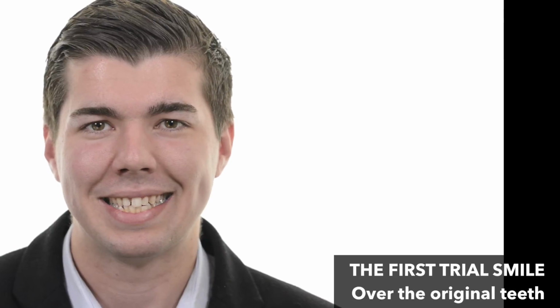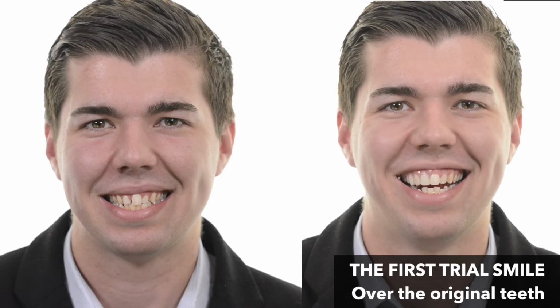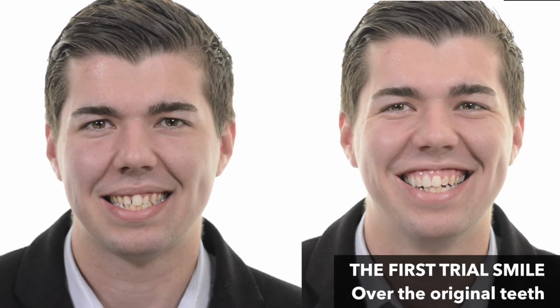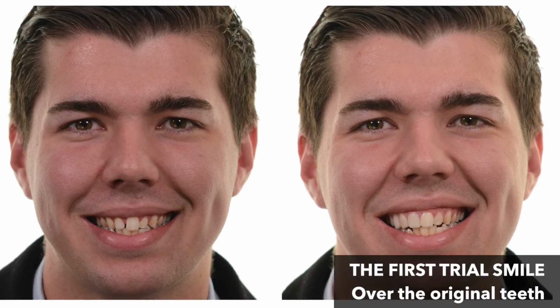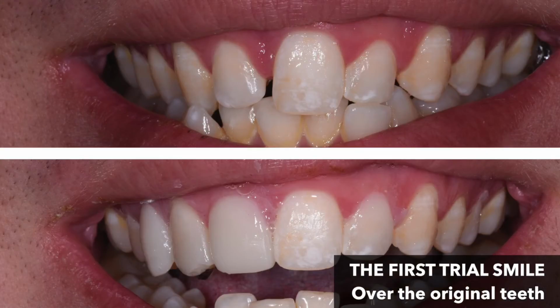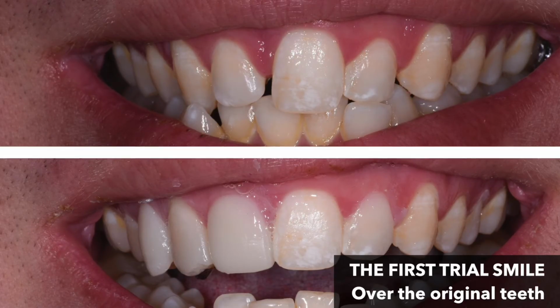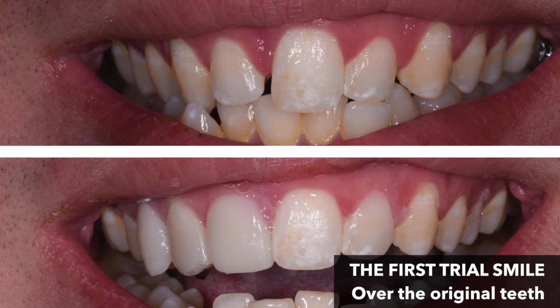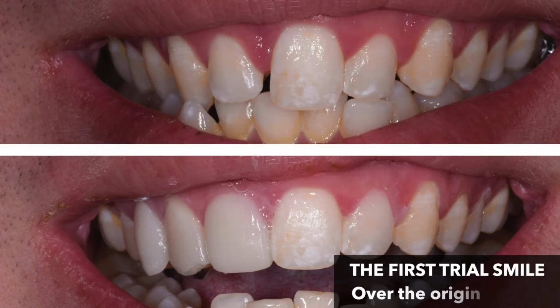One of the really nice things is doing what we call a trial smile before we even decide on treatment, allowing Cameron to decide on whether he would like to go ahead with treatment. So this is an example of a trial smile over the top of his teeth, and you can see the before and after here where you can see an obvious difference. A close-up shows that all we've really done is cover his right hand side lateral tooth to make it shape more like a central tooth, and we've also turned the canine into a lateral tooth and his premolar on his right hand side into a canine tooth.